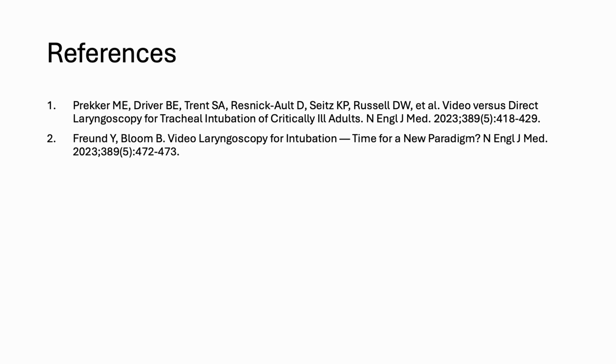References. These are the key references for today's presentation. The device trial is a pivotal study that directly compares video and direct laryngoscopy in critically ill adults, providing robust evidence for the higher first attempt success rate with video laryngoscopy. The editorial by Freund and Bloom offers insightful commentary on the trial's implications and the importance of training in achieving these outcomes. I encourage you to review these articles for a deeper understanding of the topic.